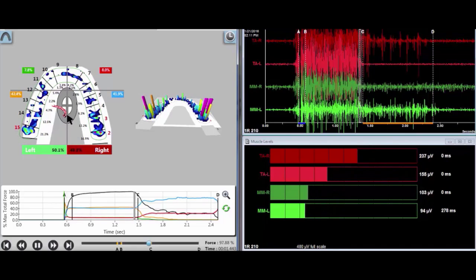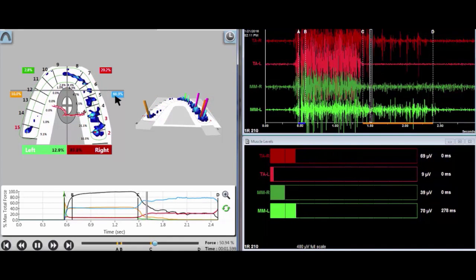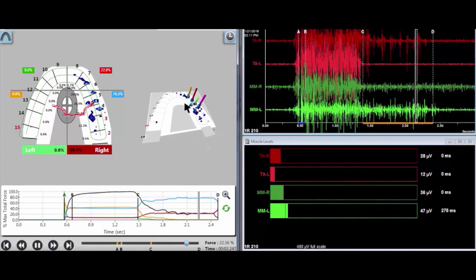At the C line, the patient makes the excursion to the right. The red represents the percentage of force touching the anterior teeth in the excursion, the blue, the working, posterior. Notice the blue working, persistent on the graphical interface. This is hyperfunctioning the muscles of mastication. Thus, this patient's disclusion time is long due to the posterior working and balancing contacts, slowing things up.